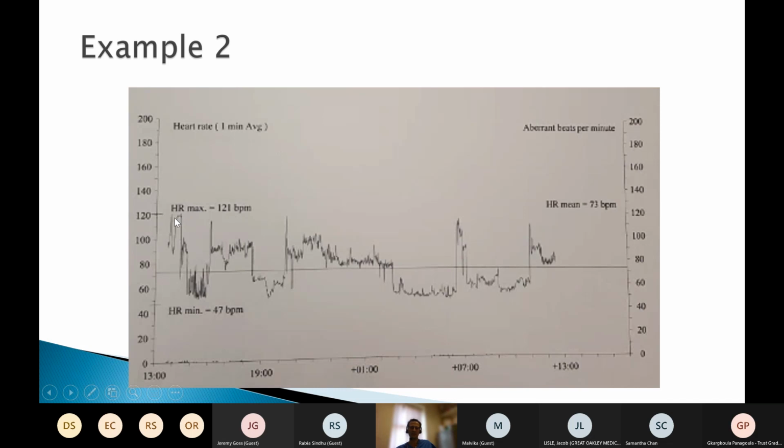Thanks, Jacob. Well, yes, it is. Rate of 120. That is a bit high, but that's not that high. Your heart rate probably exceeds 120 at some point during each day. I hope it does, because you hope you do some regular exercise. So depending upon the patient, you might say that this 90-year-old has got quite a fast heart rate at some times, but it's not really of concern how fast it's going. Anybody else want to make a comment?